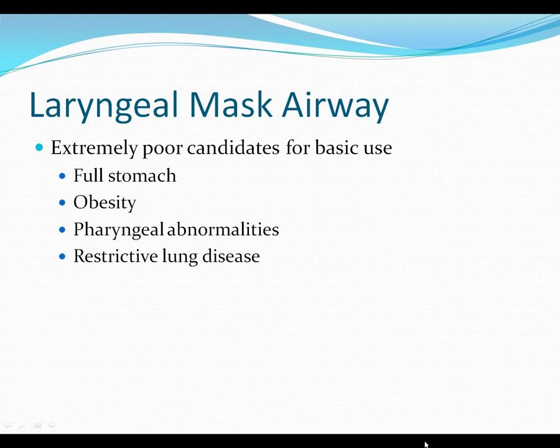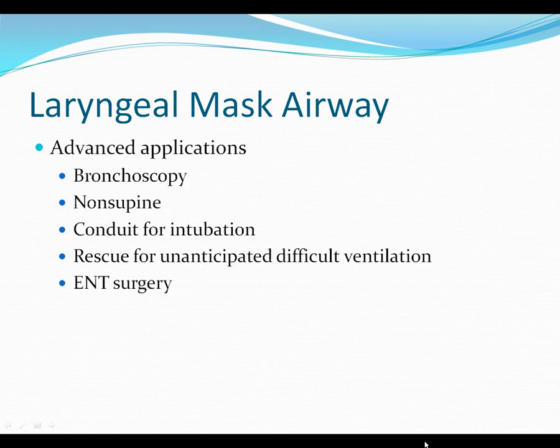Pharyngeal abnormalities and restrictive lung disease. Restrictive lung disease for the same reason. If you wanted to deliver positive pressure breaths, you would need high pressures, and you're not protected against filling the stomach, etc. But the real beauty of the LMA are some of these advanced applications.